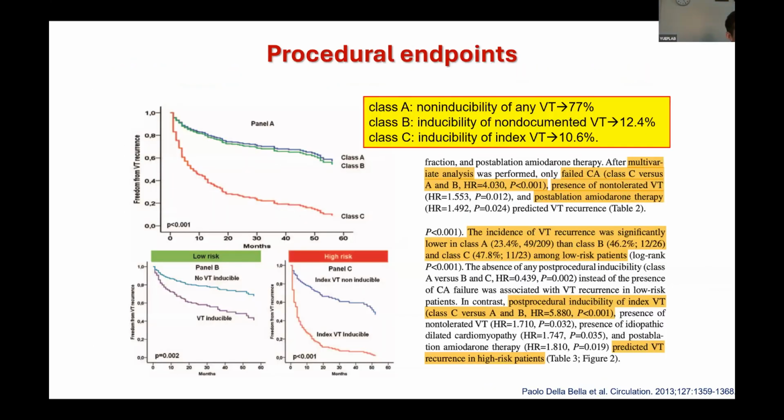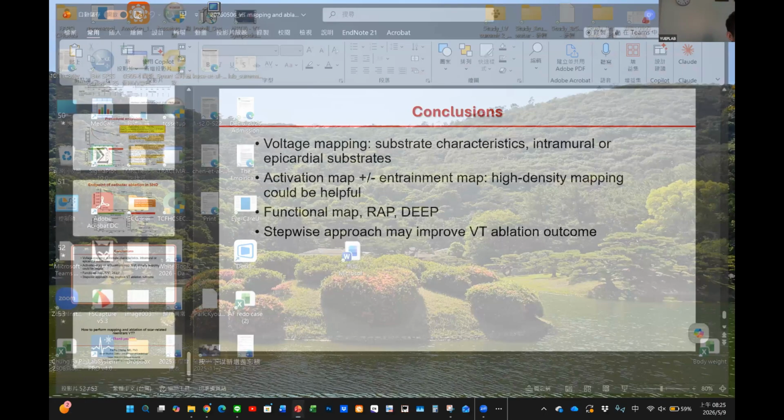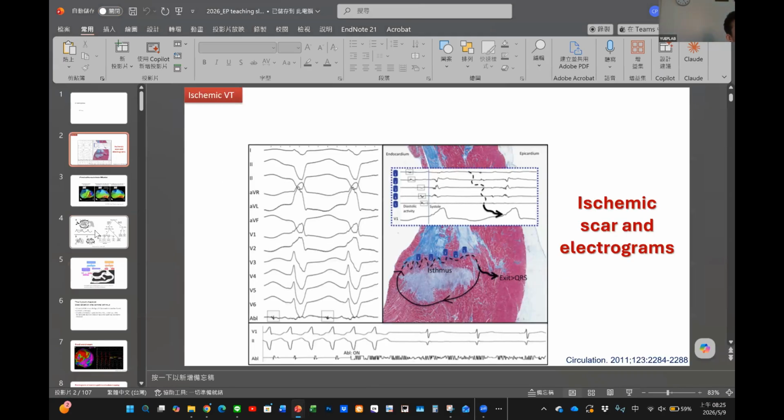So okay, I want to skip this one, but I would like to share something also about the entrainment. This is the teaching slides for my fellows.